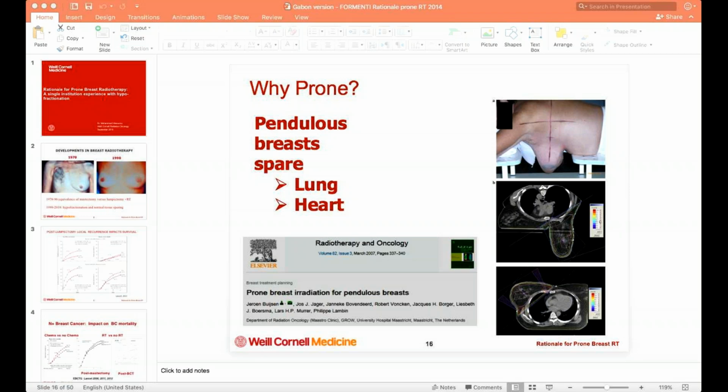If it is, then maybe you have to make a clinical judgment to cut off some of the scar. You wouldn't want to start treating the contralateral breast and normal tissues too much. But if it's extending posteriorly, then you can hopefully just adjust your field to include where the scar is.